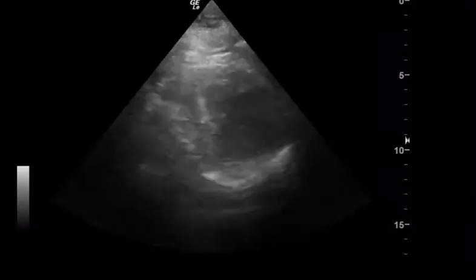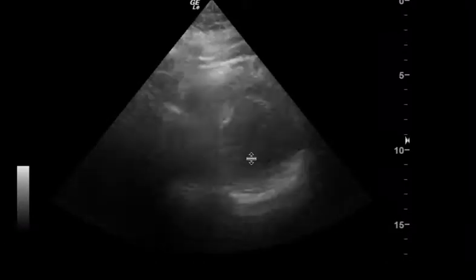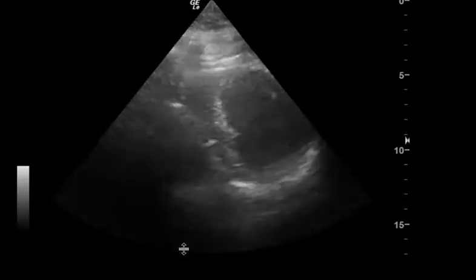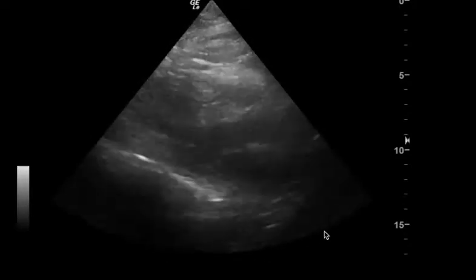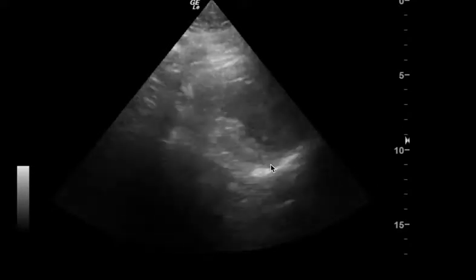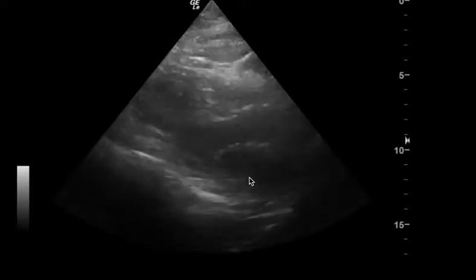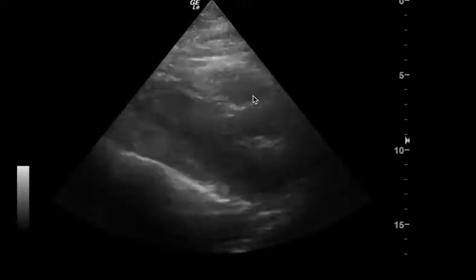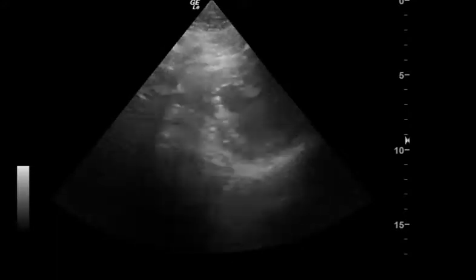However, a bedside ultrasound was done, which is seen here. You can see this is a combination of both the parasternal long view and also the parasternal short. When you take a look, you can see that the posterior wall here and lateral wall seems to be moving okay. However, the anterior wall really isn't moving as good as you would like.